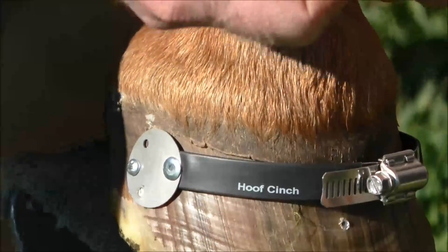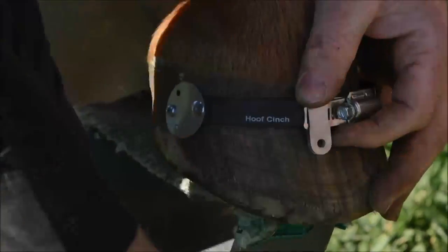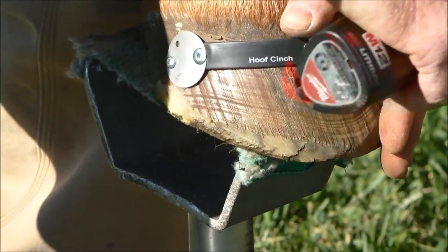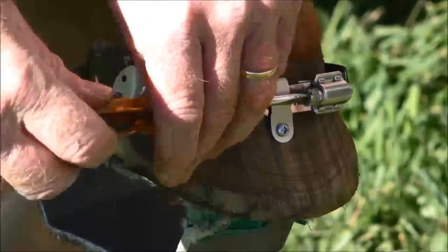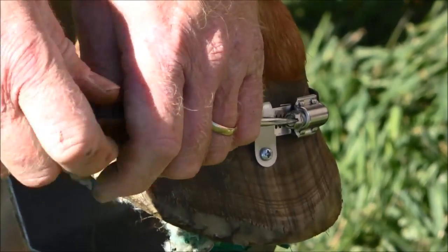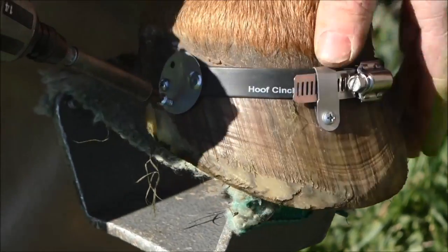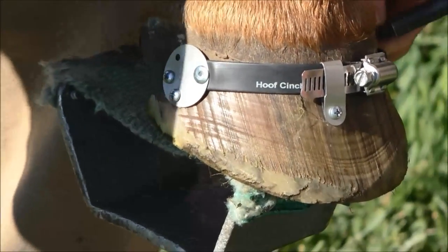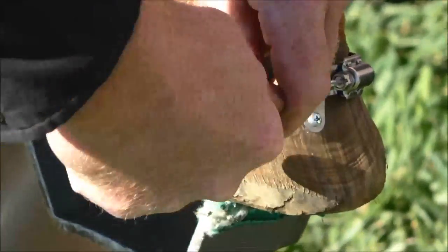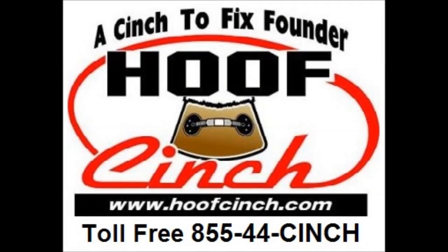Once again, about an inch below the coronary band, then fold the hold down tab in half. Snug the band up so it's laying flat on the foot — though the band does not have to lay perfectly flat; it can have a space at the top if you have a different angle on the horse's foot. Then tighten it all the way — get it snug until you pop out and you're done. Thank you very much.